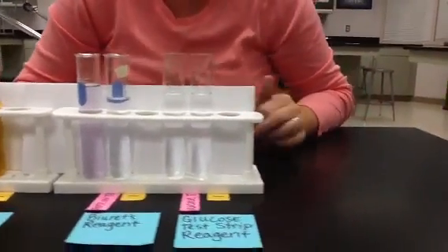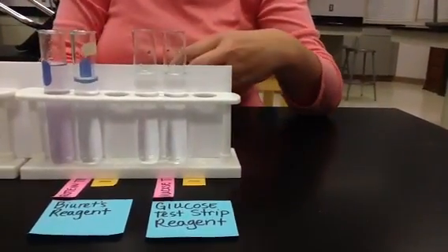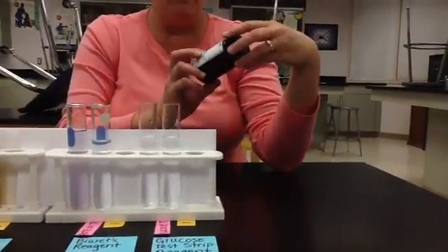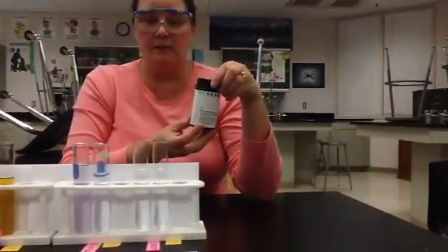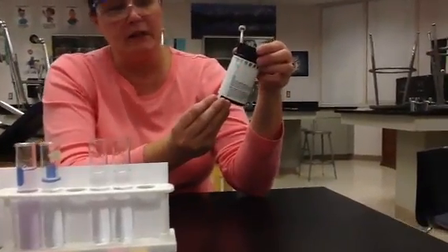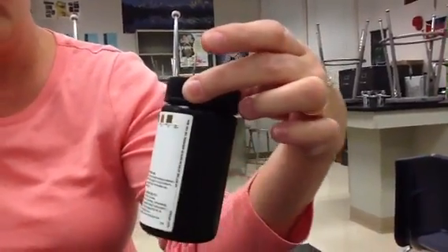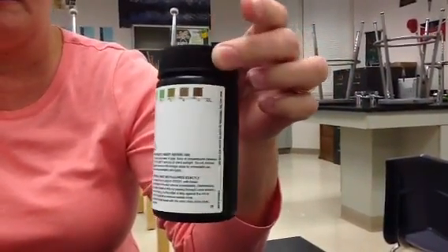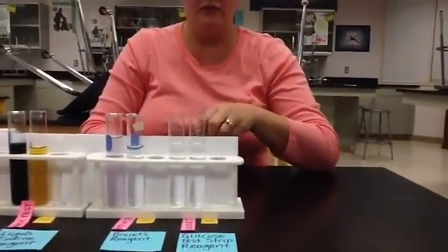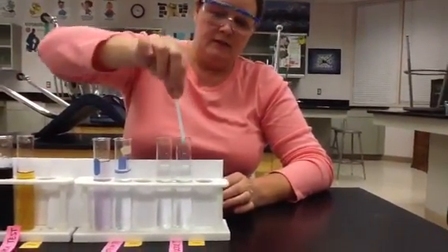The last one we're going to do is our glucose test, and that again is a sugar. So we have these special strips called urinalysis test strips, and they actually test for the presence of glucose. So I have a strip here, and a negative test is this light blue. And anything that changes beyond that, from that light green to brown, is considered a positive test. So we're going to dip our first one into the negative one, and it should stay hopefully blue. We're going to let that sit and rest for a second.